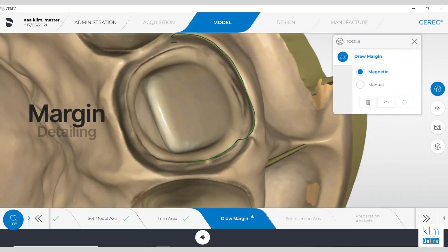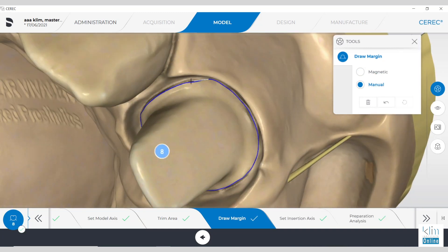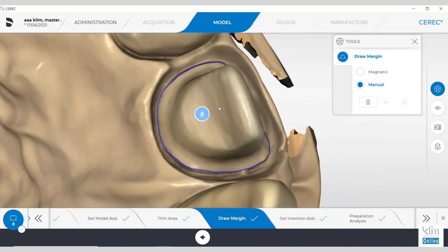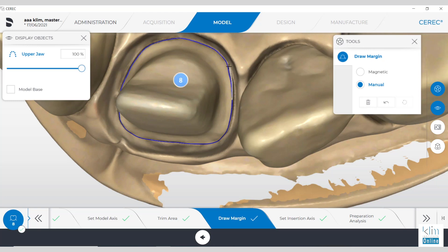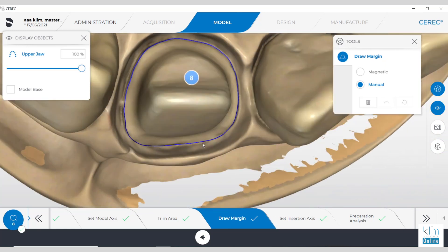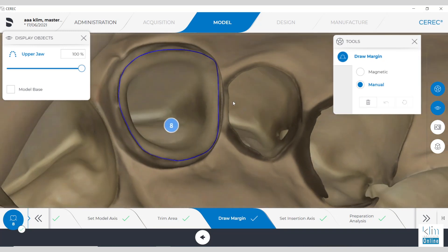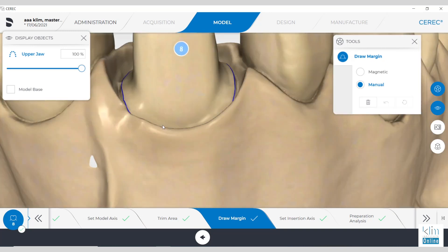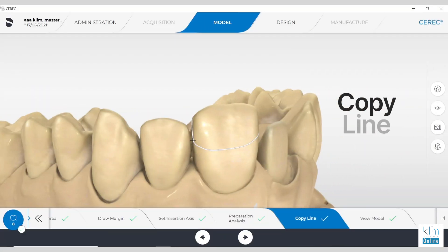Our next step is to detail and draw the margins. This is a nice feature, particularly with the prime scan, even though this is on a model. We can see margin clarity extremely well in prime scan, and I'm very grateful for that. When we need a better view of that margin for clarity, turn the model upside down with the model base off — we can see a really nice outline of the margin, particularly if it's sub-gingival.